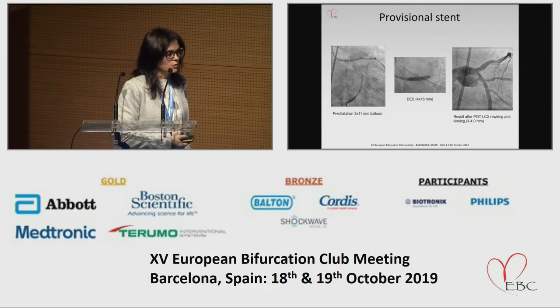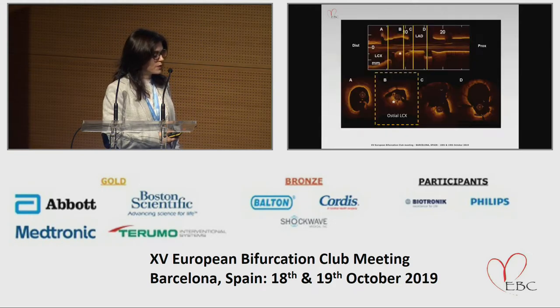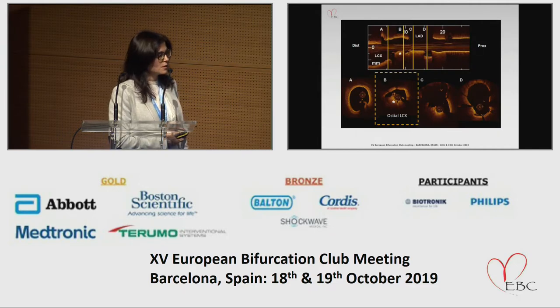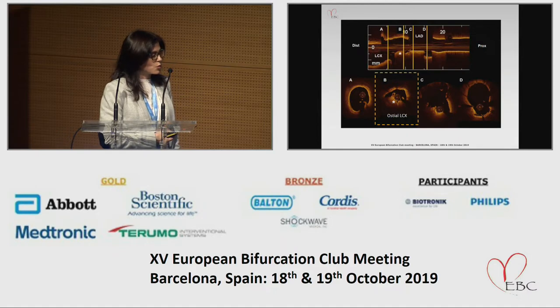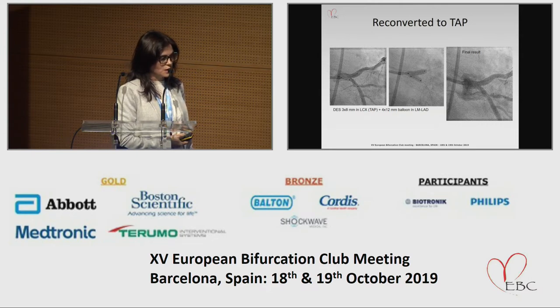after that, we, of course, did a POT, rewired, performed a kissing, and this is the result. And now we are not really happy, of course, about the result at the ostium of the circ. We want to check what happened there. And if you do an OCT now, well, you can see that actually there is a dissection in the ostium of the circ that is actually creating this pinching that you can see in angiography. And of course, we thought we needed to fix that, so we reconverted it to TAP. And this is the final result that you can see on the right panel after TAP.